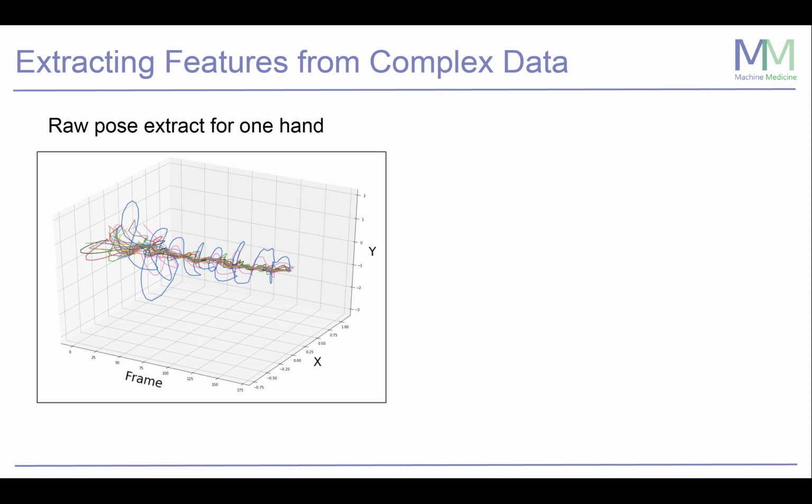So what exactly does the analytics look like? How exactly are we going about extracting these features? So I'll walk you through one or two, and that should give you some flavor of how exactly this technology works. This is a figure that we've seen briefly before, showing a three-dimensional representation of finger tapping, so the XY coordinates for the right hand on a patient who's performing finger tapping.